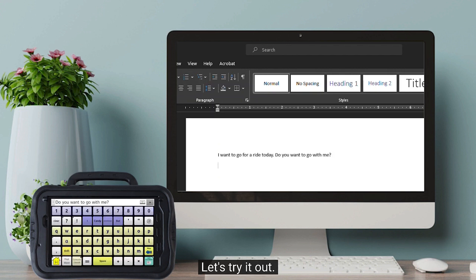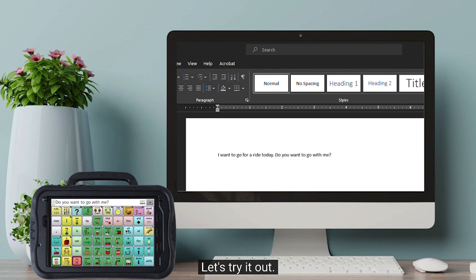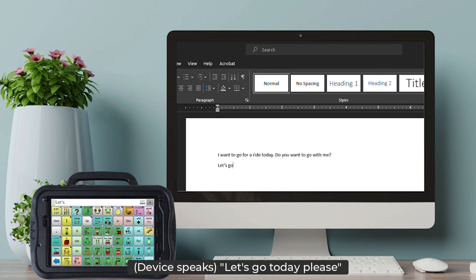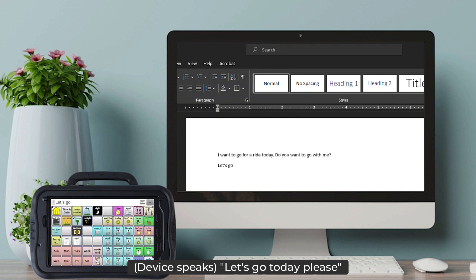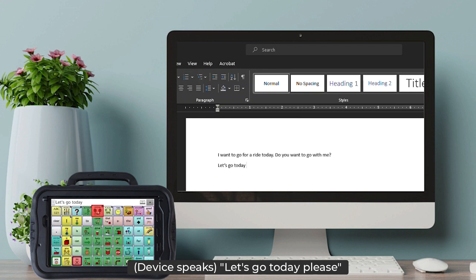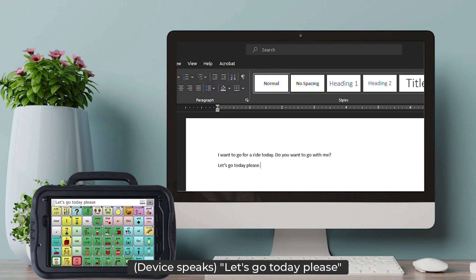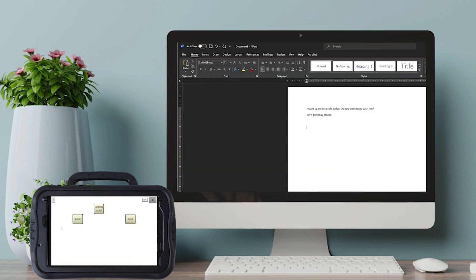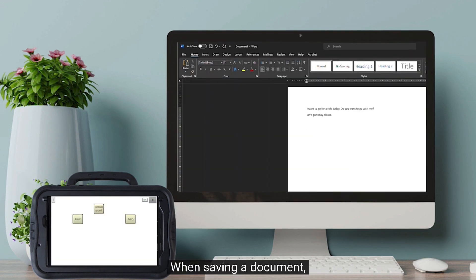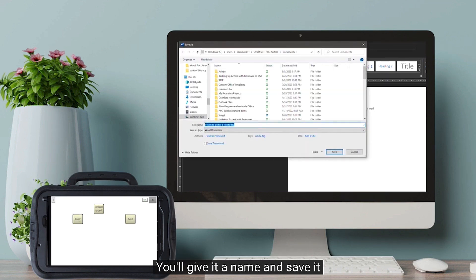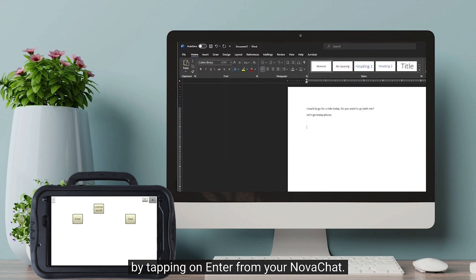Let's try it out. Creating the message: "Let's go today, please." When saving a document, a pop-up will show up on your computer screen. You'll give it a name and save it by tapping on Enter from your NovaChat.